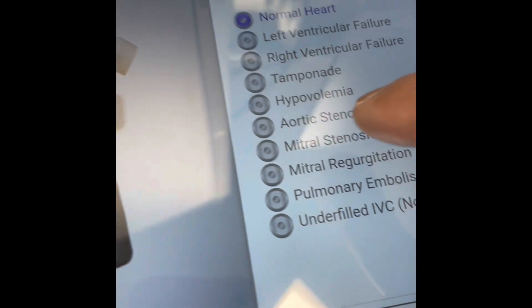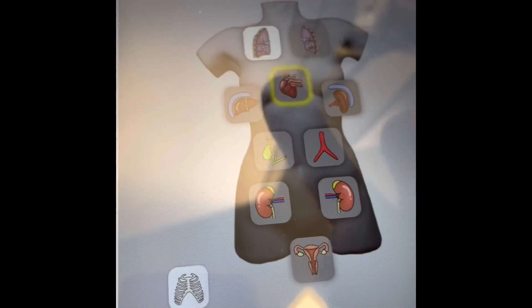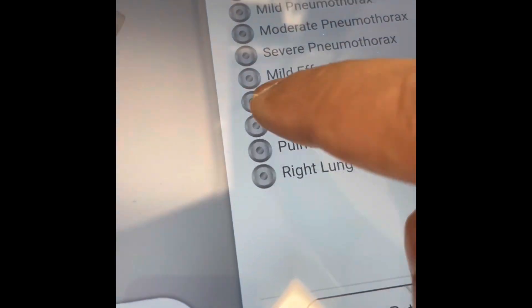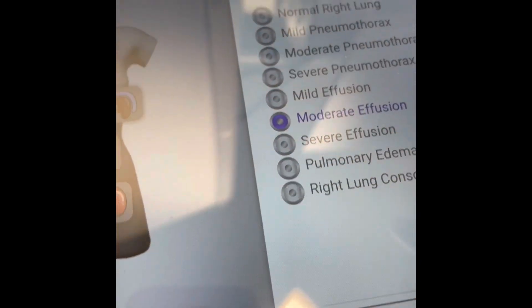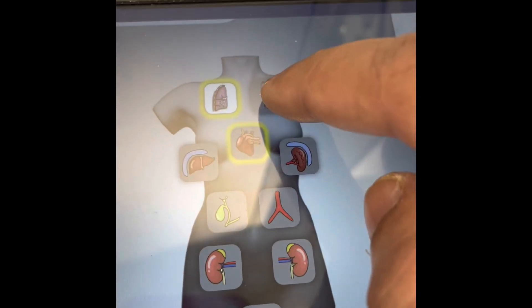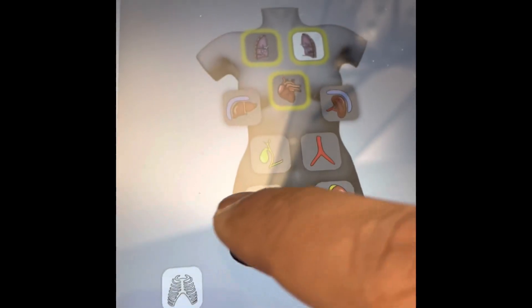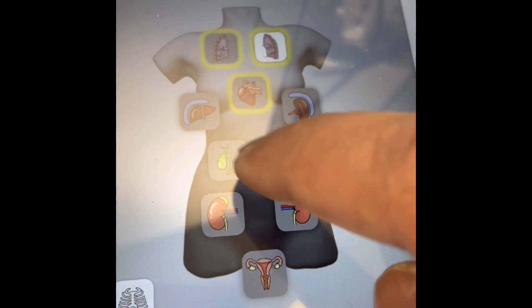but I can choose, for example, to make her have a cardiac tamponade. I could choose to make her have a moderate effusion on the right side. And let's do a severe pneumothorax on the left. I can make her have a gallbladder stone.